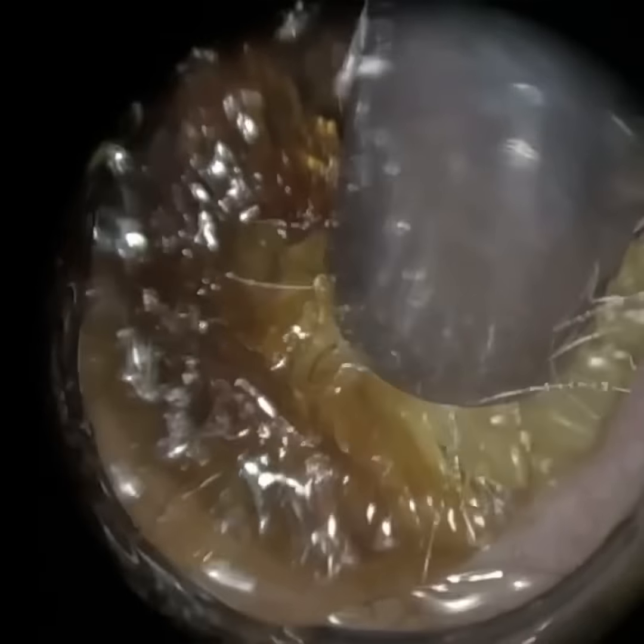There was a slight widening in the midsection of the ear canal. And Keratosis obturans is more common with patients below the age of 40 as well. And possibly the reason for that is, one reason for a lot of dead skin is inflammation in the ear, or a high rate of blood flow. So the more inflammation and blood flow you have in the ear, the more the ear turns over dead skin and produces new skin. So it did fit the classification of Keratosis obturans.